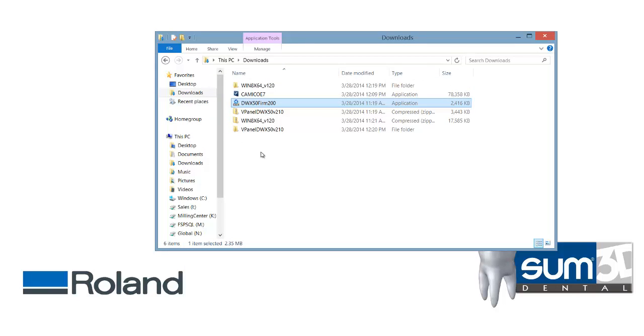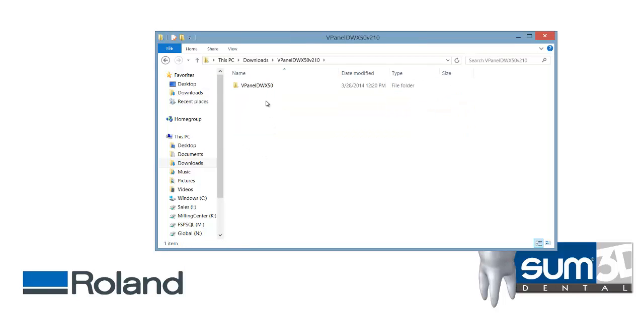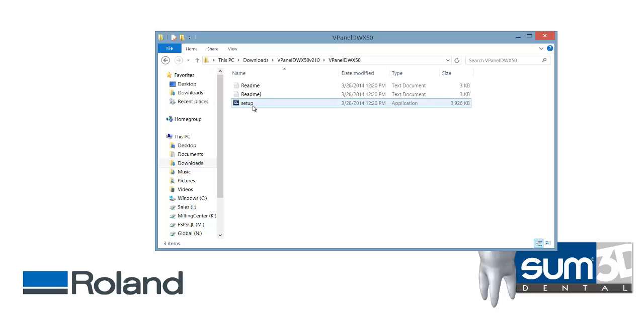After the firmware has been updated, you need to update the vPanel. You can do that by running the setup.